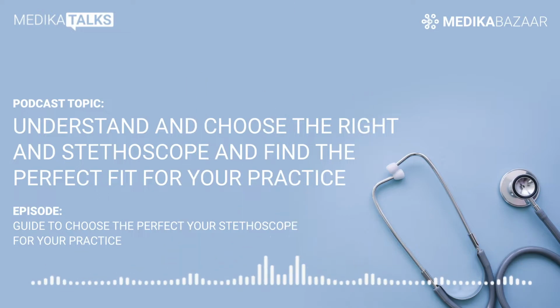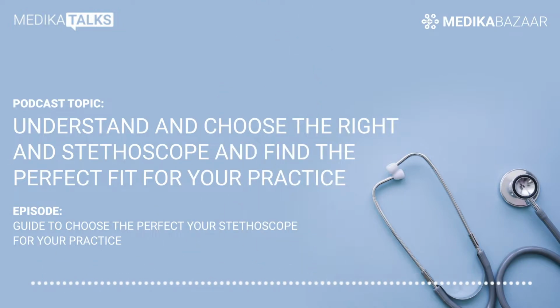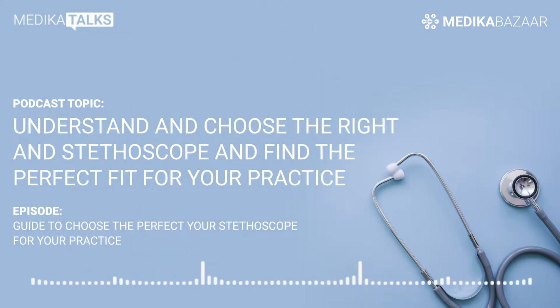What are the parts of a stethoscope? Important aspects of a standard stethoscope include the earpiece, the tubing and its length, and the chest piece and its shape. Stethoscopes now come in a choice of standard or electronic. Although electronic stethoscopes are state of the art and look high-tech, they are not necessary for everyone.